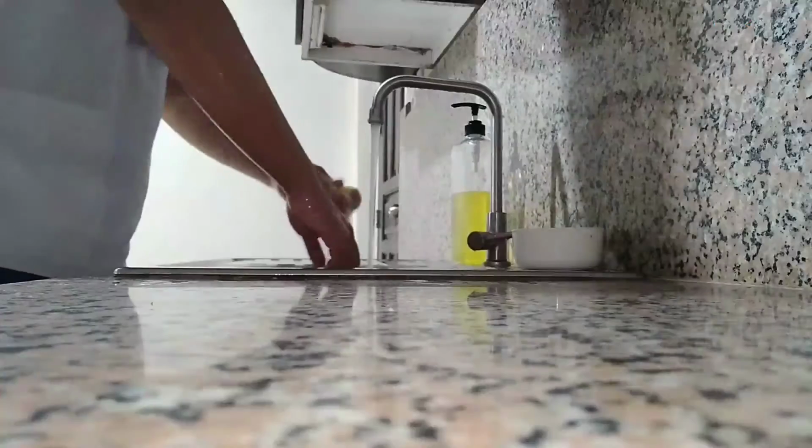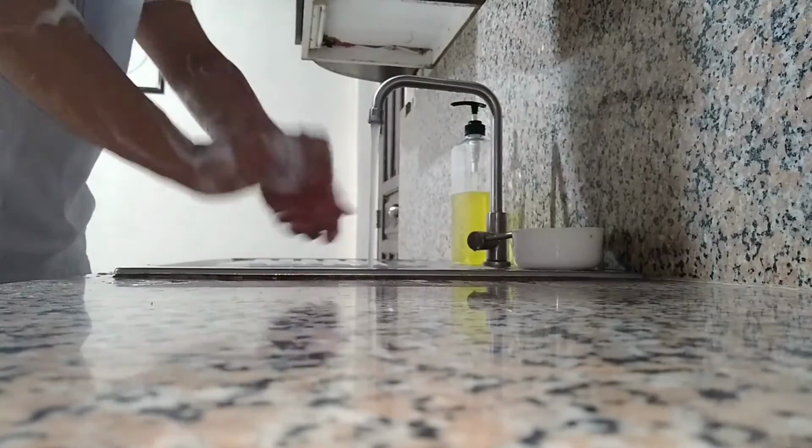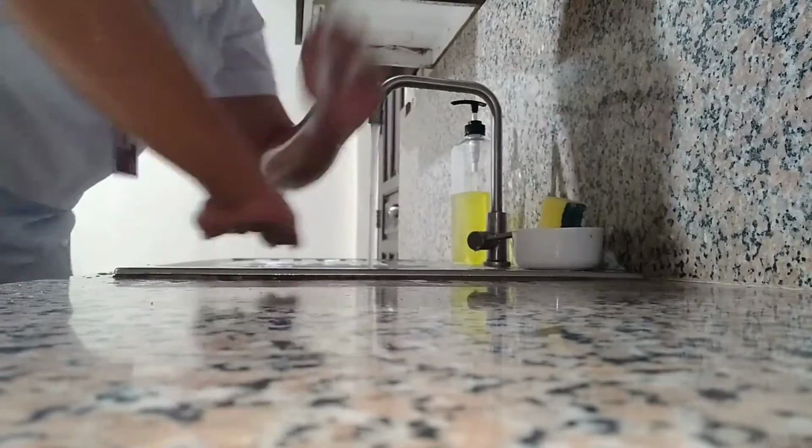Thank you, sir. And then we're going to perform hand hygiene and observe other appropriate infection control procedures. And we're going to provide for our client's privacy by drawing the curtain and closing the door in the room. And now we're going to prepare all the equipment needed.